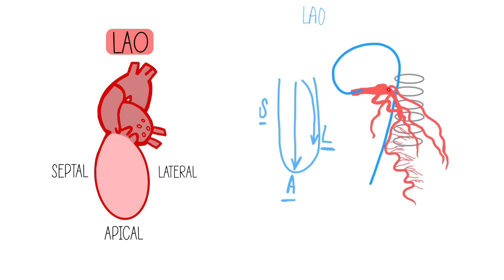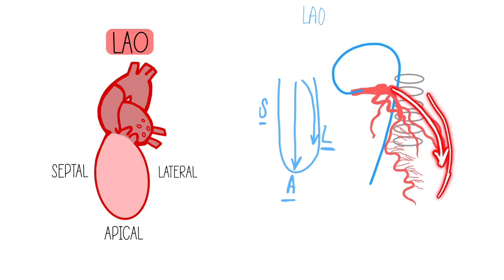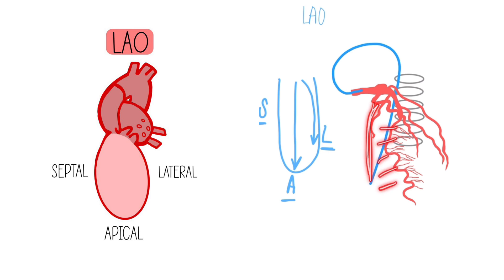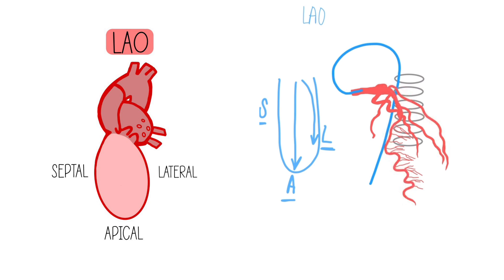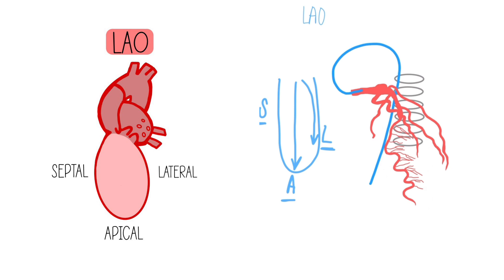That vessel pointing down in the middle towards the apex is the LAD, and the branches coming over to the lateral wall have to be part of the circumflex system. The septal perforators would be going towards the septal wall. Between the LAD and the circumflex, you can definitely see all of the LAD really well here, so that makes it a cranial view. You would call this LAO cranial.